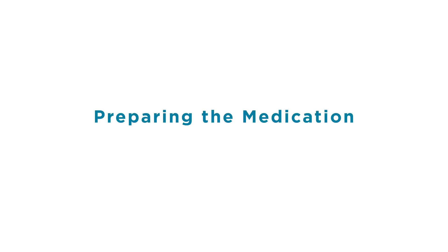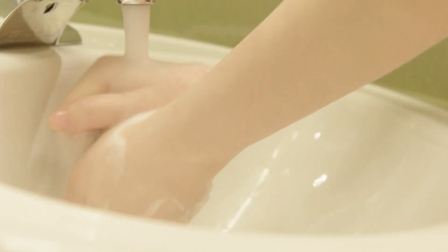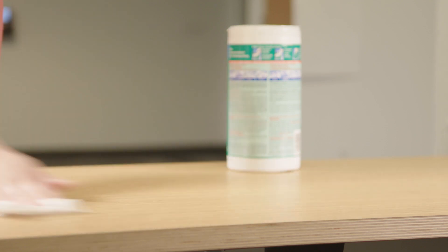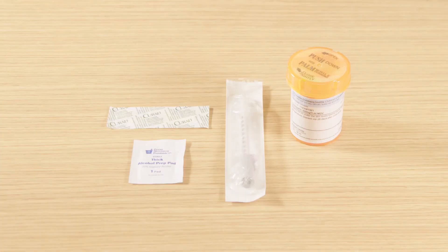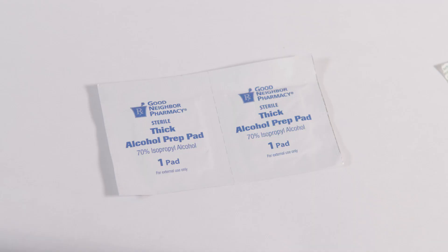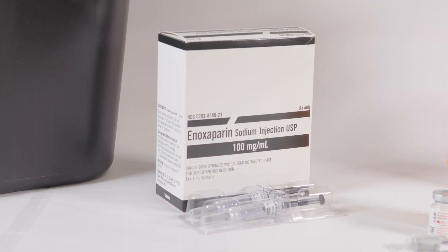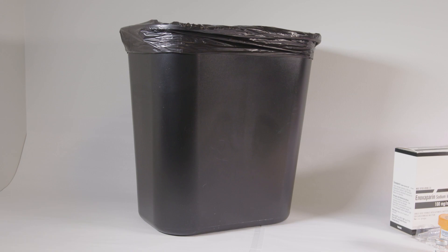Let's get started. Wash hands with soap and warm water for 20 seconds, or use hand sanitizer. Use a clean work area to lay out your supplies, or lay down a clean towel to make a clean area. Before you begin, you will need a band-aid, gauze or tissue, alcohol wipes, the vial of medicine with an empty sterile syringe, or a pre-filled syringe of medication. Also have your sharps container and trash container nearby.